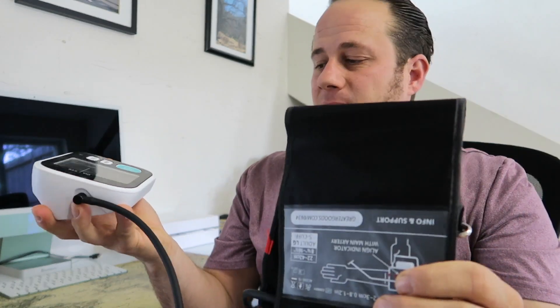I liked that it includes Bluetooth and it syncs to my phone, so that way I'm not accidentally missing a recording. I can report directly what I get because it's all stored right on my phone on the app.